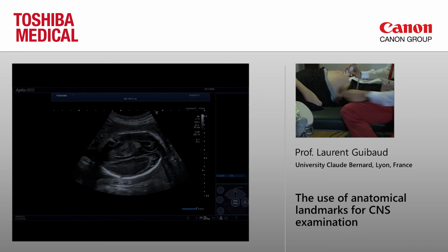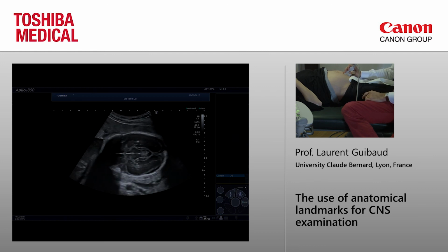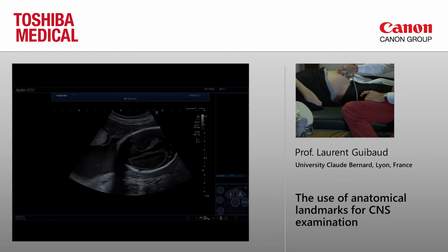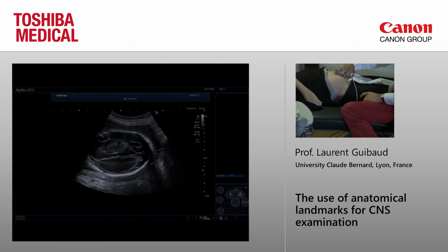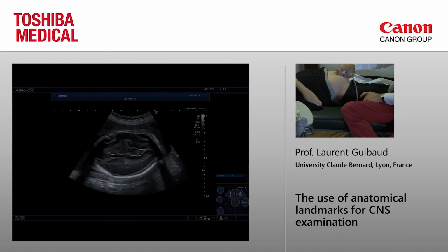So if you see my hand, I was like that, and I will push my probe close to the belly of the patient, and I can have a look at the proximal hemisphere.